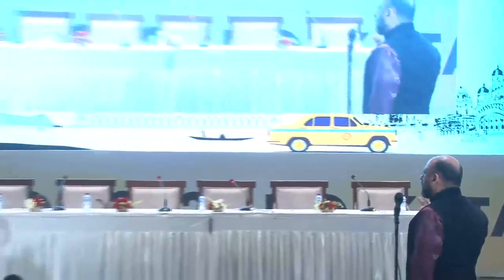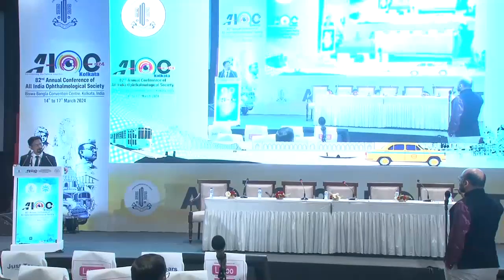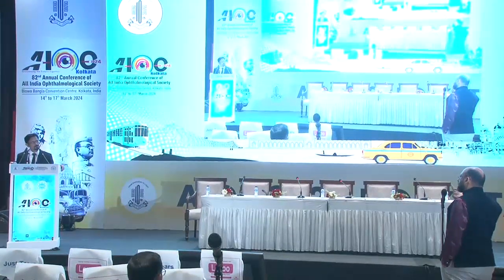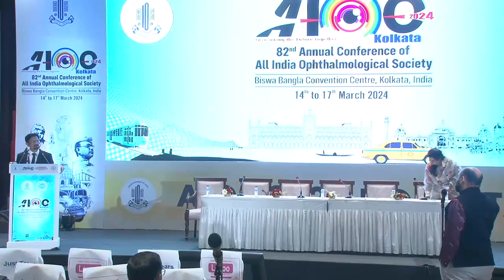Yeah, our learning in the initial cases of SMILE has been, Rajesh, one, make sure that the dissection goes above and below the lenticule 360 degrees. Even near the incision, sometimes for small incisions, it is slightly difficult. But the peripheral part up to maybe one clock hour on each side will come off. Usually what we tell most people who are learning it is to push it away and then bring it out, so that the edges near the incision also get cut. Absolutely. The second was the type of instrument.